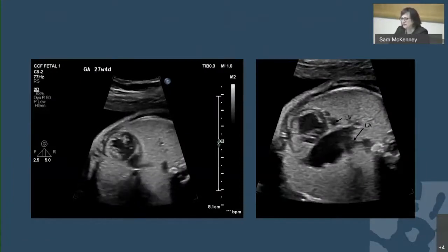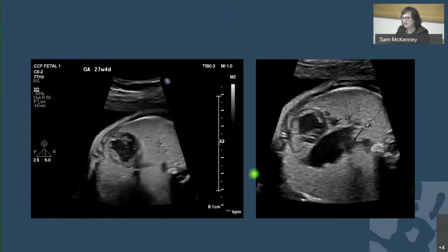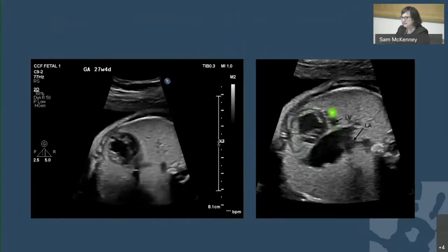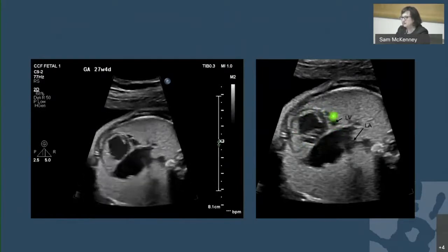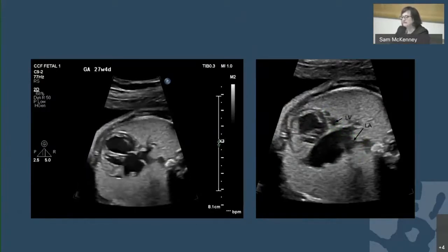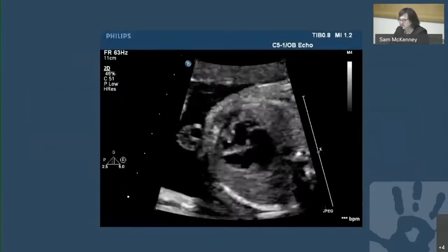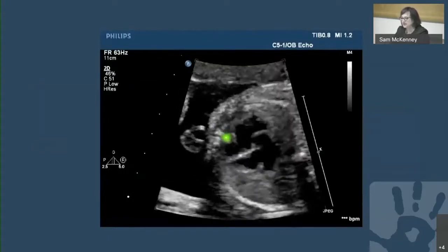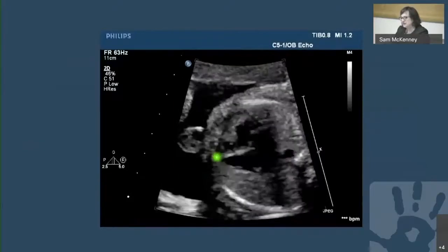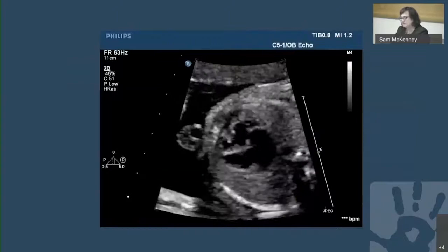This is a fetus with complex congenital heart disease, basically hypoplastic left heart syndrome. What you could see in this still image is that there's a large right ventricle here, but this is the sliver of left ventricle. There's mitral atresia, there's a smaller but fairly normal left atrium as labeled right here. Other forms of what we call single ventricle hearts include tricuspid atresia, which is what's shown here. So this is a normal left ventricle right here. The right ventricle in this case is quite hypoplastic with atresia or non-development of the tricuspid valve.